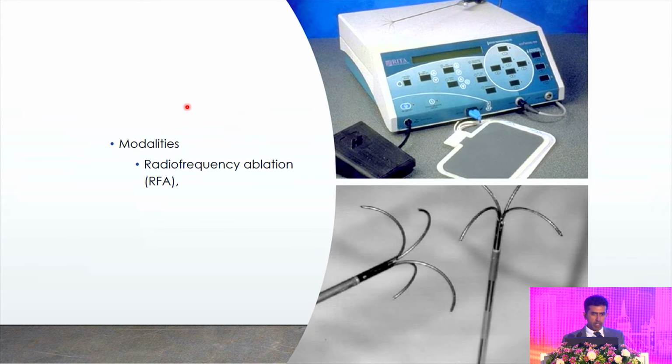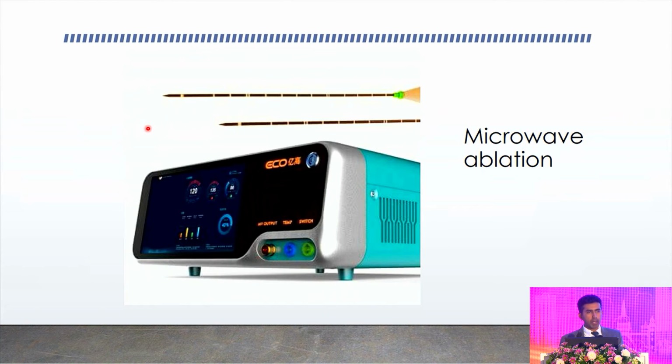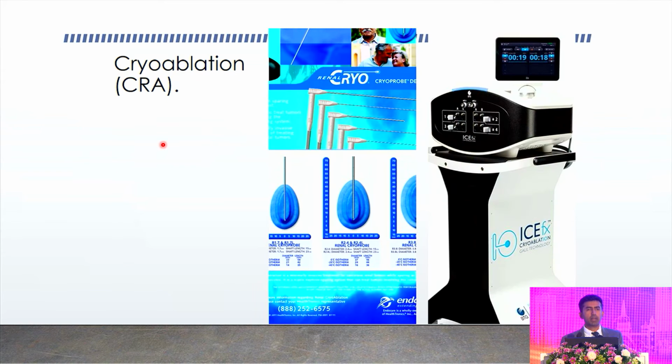There are different modalities: radiofrequency ablation, microwave ablation, and cryoablation. The first two are available in Sri Lanka. Cryoablation we are not using at the moment in Sri Lanka.